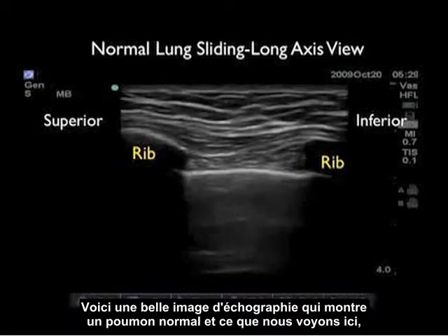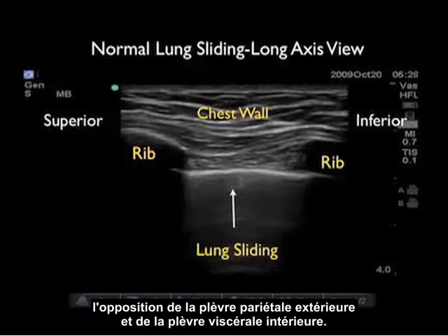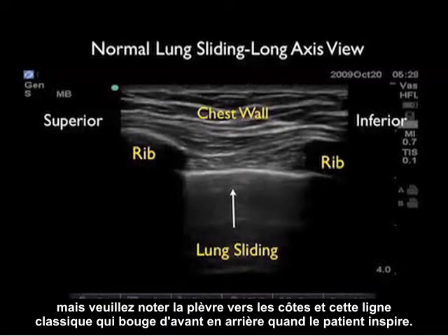Here's an ultrasound image showing a normal lung. We're in the long axis configuration — superior rib to the left, inferior rib to the right. Chest wall anteriorly, and we see lung sliding, which is the opposition of the outer parietal and the inner visceral pleura. We see the vertical comet tails coming off the back of the pleura. This is a completely normal exam — no pneumothorax. Note the location of the pleura, deep to the ribs, and that classic shimmering line back and forth as the patient takes a breath.